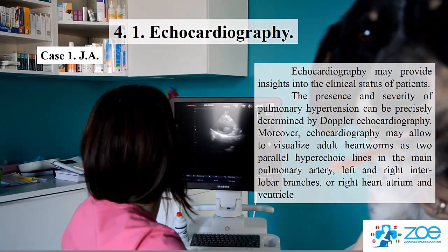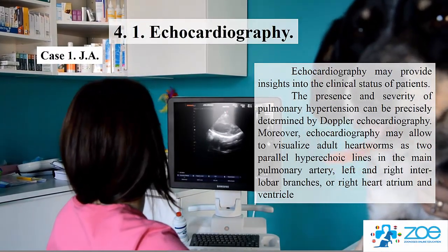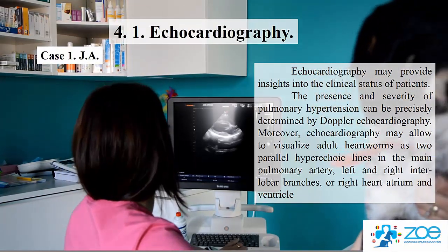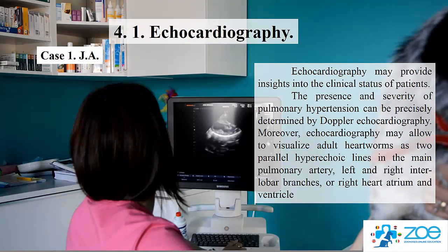Echocardiography may provide insights into the clinical status of patients. The presence and severity of pulmonary hypertension can be precisely determined by Doppler echocardiography. Moreover, echocardiography may allow to visualize adult heartworms as two parallel hyperechoic lines in the main pulmonary artery, left and right interlobar branches, or right heart atrium and ventricle.